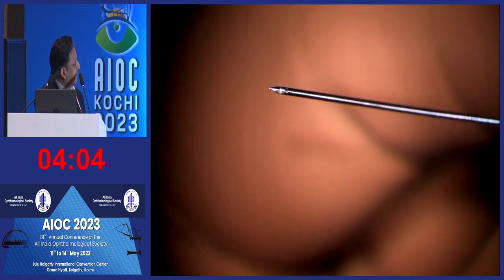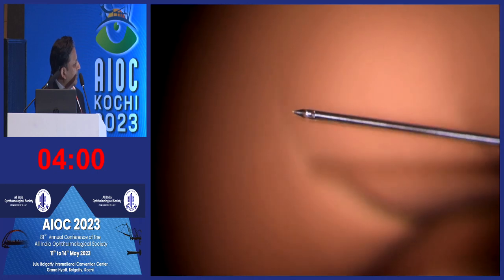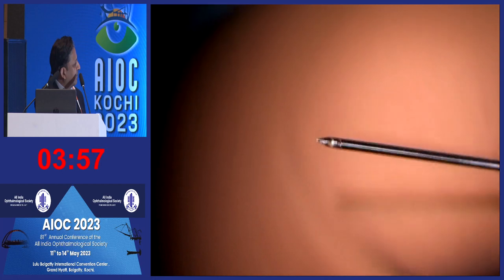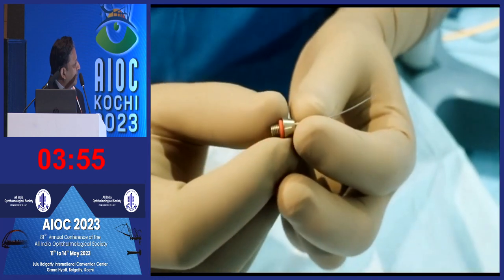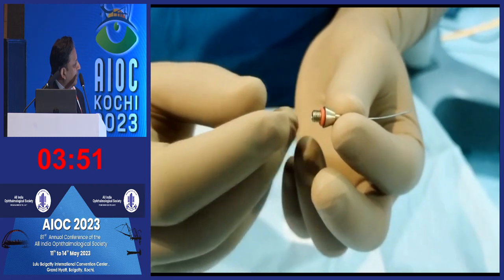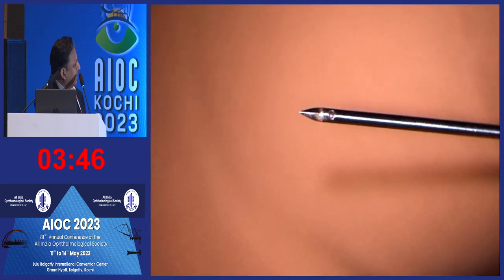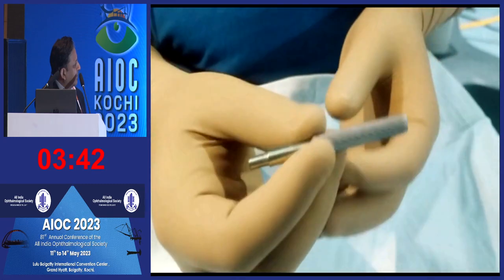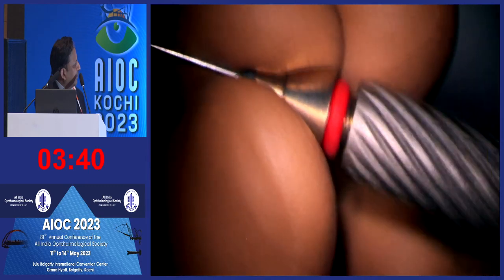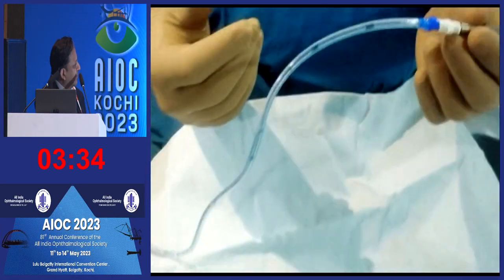Arrow is a disposable, cannulated MVR-like instrument. It is shaped like a spear in the front with a pointed tip and sharp lateral edges. The shaft is long and curved to conform to the shape of the globe. The curved shape prevents any iatrogenic damage to lens and retina. It has got a small opening just behind its sharp tip. The arrow can be connected to a reusable handle which can be further connected to the extrusion pump of vitrectomy machine. This is helpful to remove excessive bleeding, if it happens during surgery or to perform hydro or visco dissection.